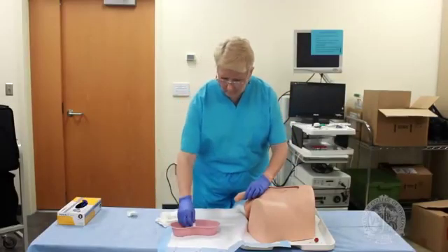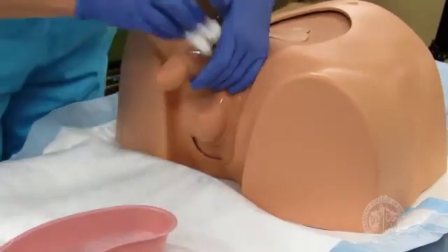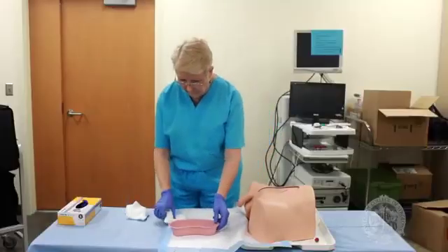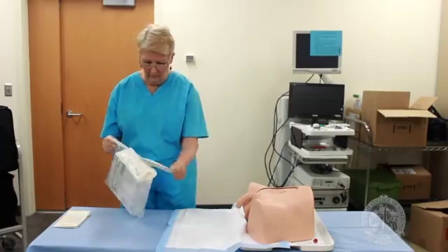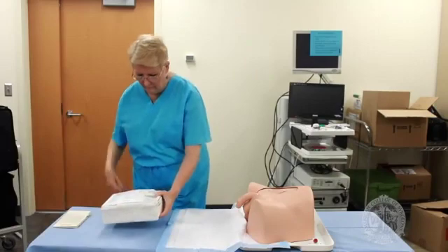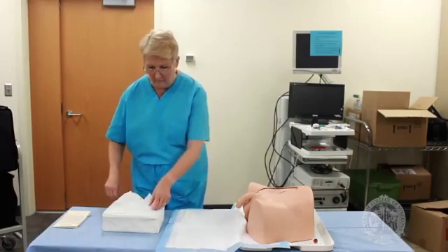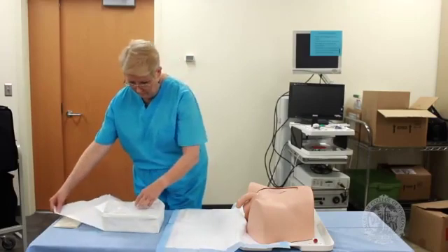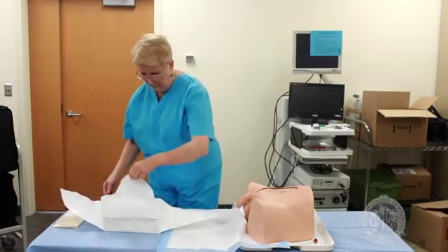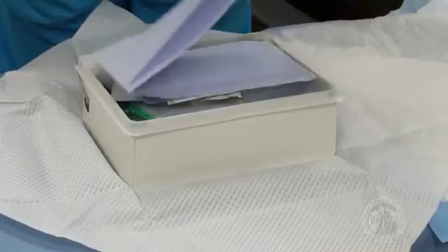Note: if you retract the foreskin, at the end of the procedure you must return the foreskin to its normal position in order to avoid iatrogenic paraphimosis, which is a urologic emergency. Now that the penis is washed, it's time to move to the sterile portion of the procedure. Open the kit to set up your sterile field near the patient. Make sure to place the sterile field in an easy-to-reach location that ergonomically works for you. You will be doing most of the work with your dominant hand, so that should be the side closer to the field.